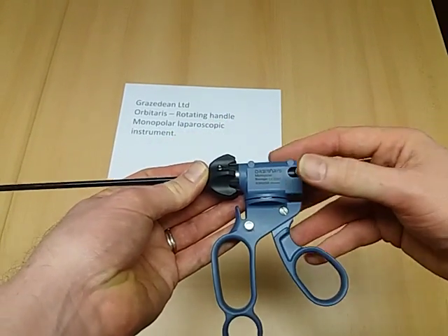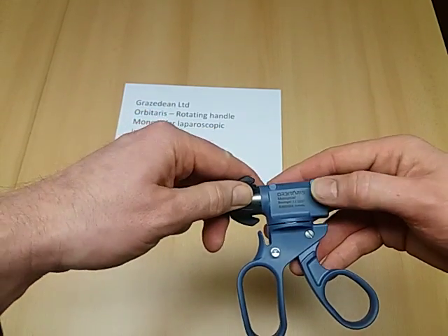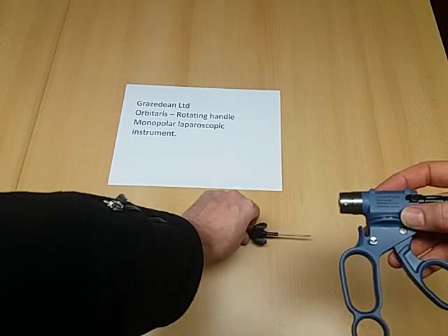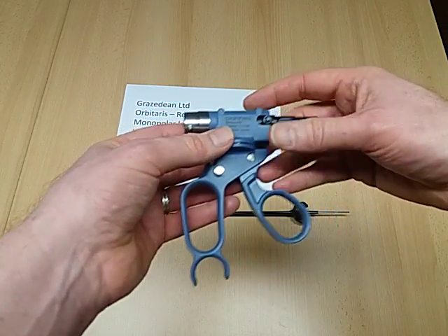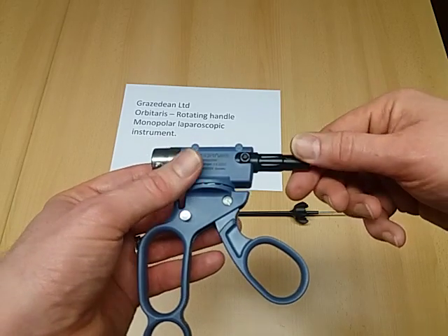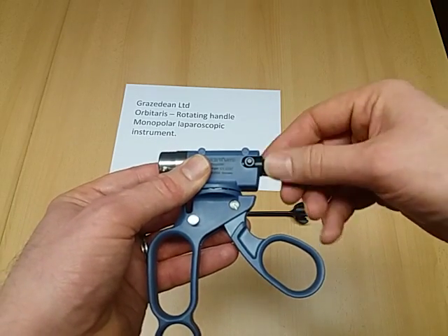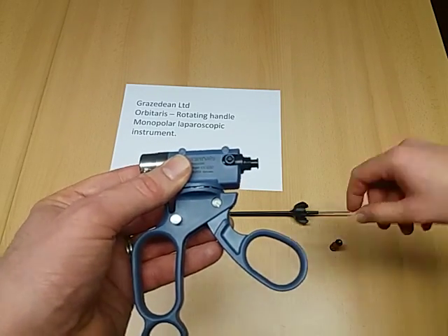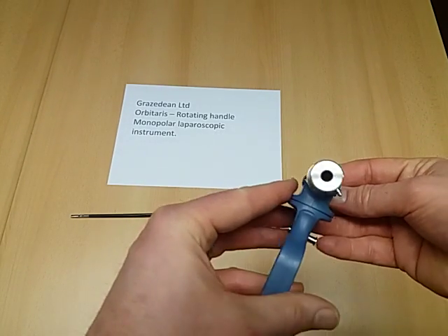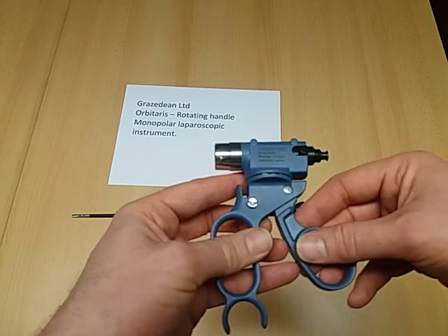The instrument comes apart into four parts for ease of cleaning. The two buttons press and the shaft and the electrode detach, and then at the back the 4 mm connector that is standard can be removed. Once removed, it exposes a lure lock which can be used to flush through the handle during cleaning.